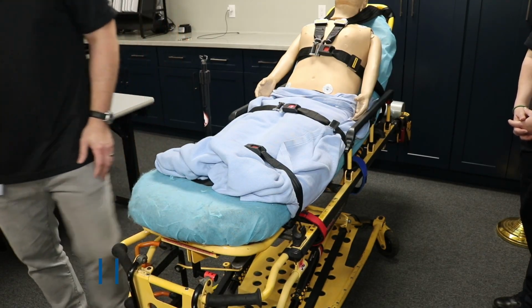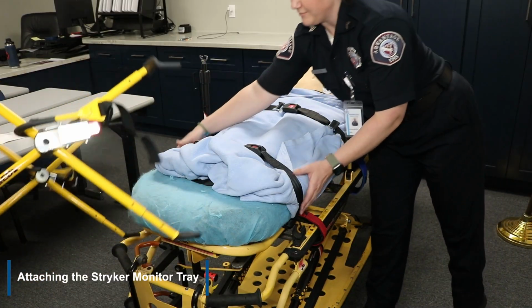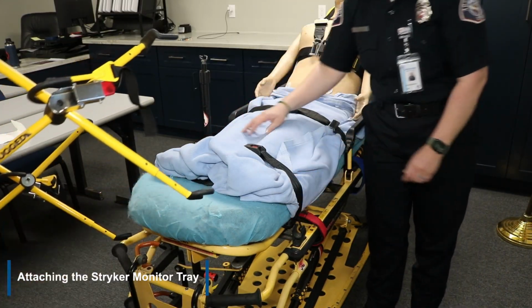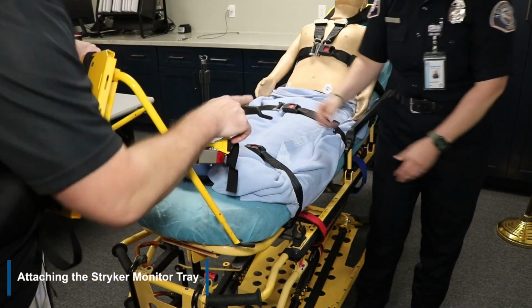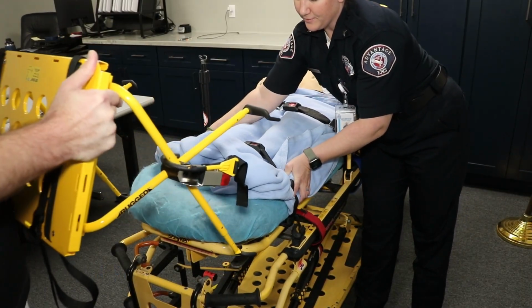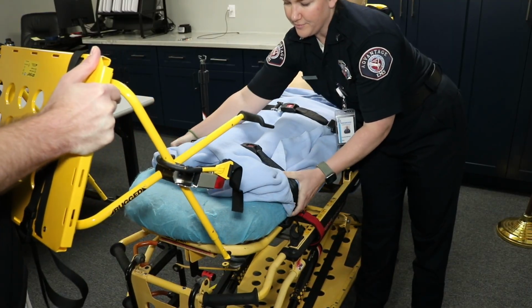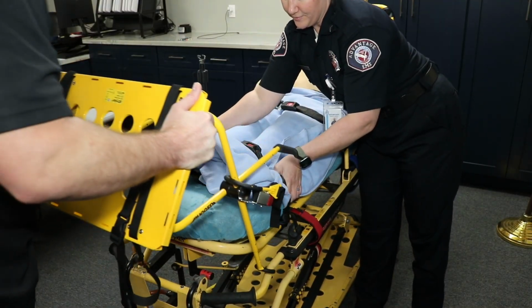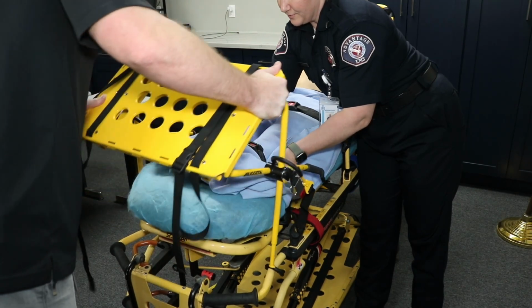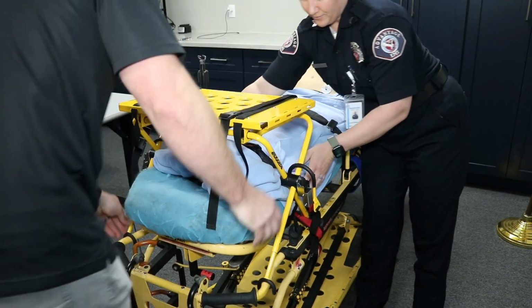Then we're going to come in with the tray. When we come in with the tray, we want to make sure these U points here are going to go onto the handle. The larger connection is going to be more towards the patient's head. Make sure you have your partner for this point because you're most likely going to need to squeeze the mattress to get it on. So we are going with these U connections here, squeeze that in so that this will sit right over the patient.